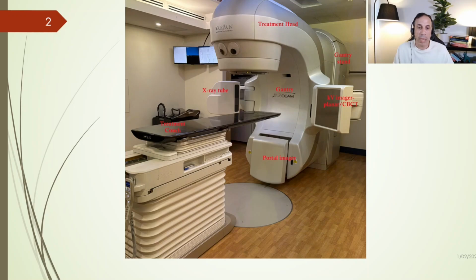In addition, modern linacs are not just treatment machines, they are also advanced image-guided radiotherapy systems. It means that they can take images before patient treatment to help the setup of the patient or during the treatment. One type of imaging, which is older than the other, is megavoltage portal imaging, which uses the treatment beam itself together with an electronic portal imaging device.